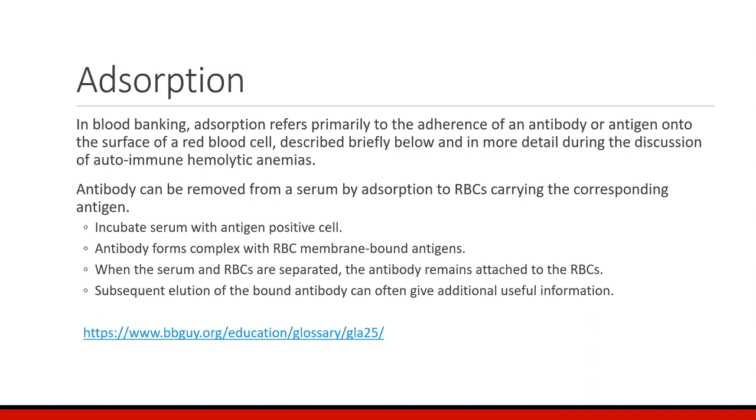And so we would wash that cell suspension, add the patient's serum, and then incubate. The antibody that's present forms a complex with the red cell membrane-bound antigens, and when the serum and RBCs are separated, the antibody remains attached to the red cells. So subsequent elution or removal of that bound antibody can often give additional useful information.